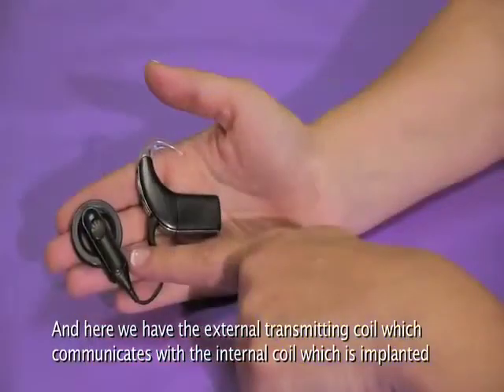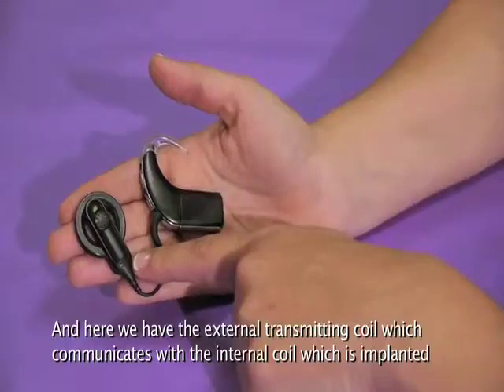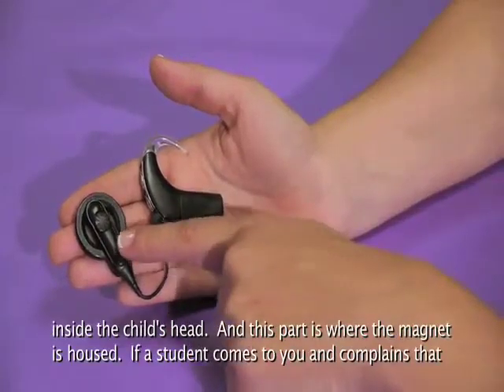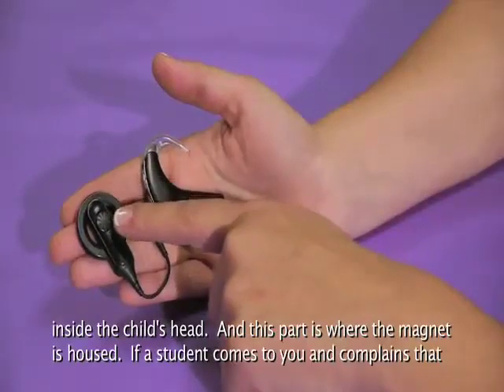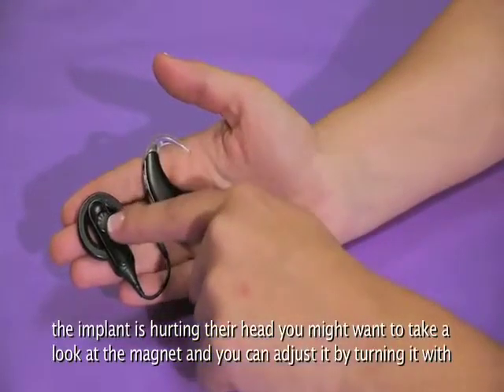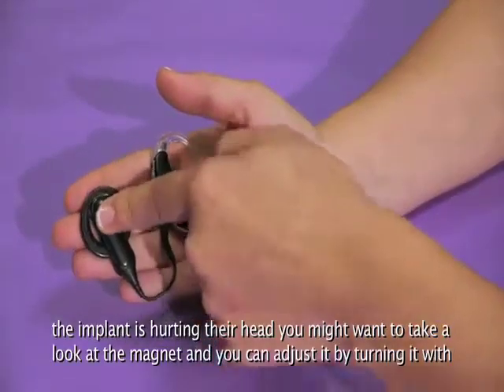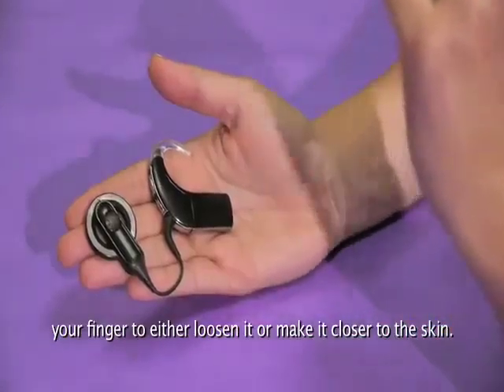Here we have the external transmitting coil, which communicates with the internal coil that's implanted inside the child's head. This part is where the magnet is housed. If a student comes to you and complains that the implant is hurting their head, you might want to take a look at the magnet. You can adjust it by turning it with your finger to either loosen it or make it closer to the skin.